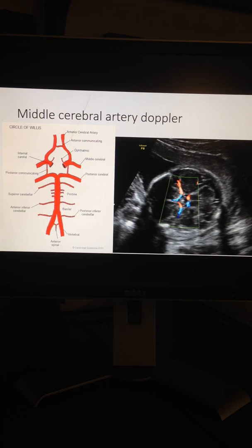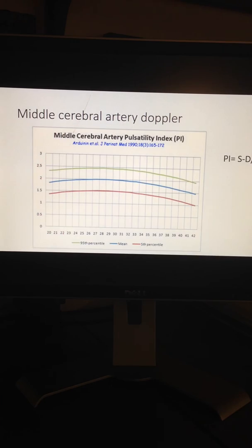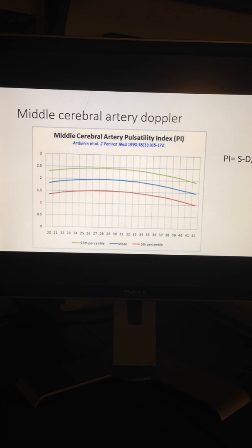Using color flow imaging, the middle cerebral artery can be seen as a major lateral branch of the circle of Willis, running anterolaterally at the borderline between the anterior and middle cerebral fossa. Here, an axial section of the fetal head is obtained at the level of the sphenoid bone. The blood velocity increases with advancing gestation, and this increase is significantly associated with a decrease in pulsatility index.